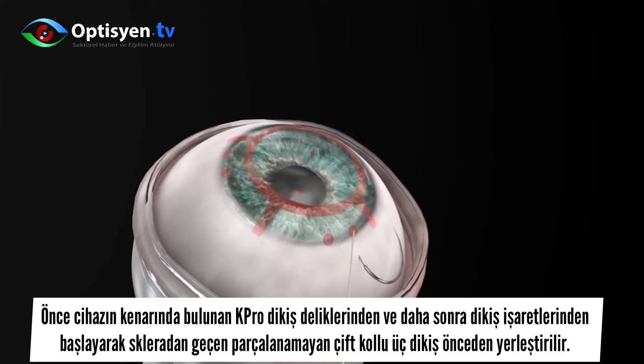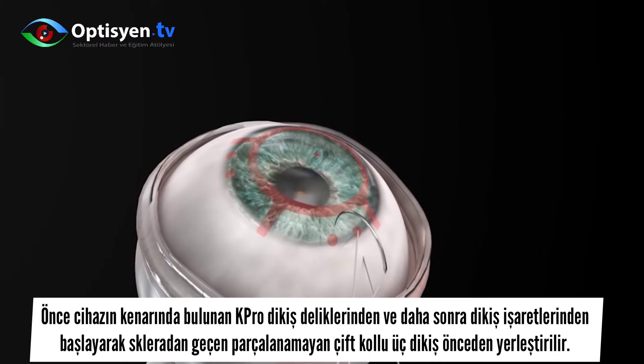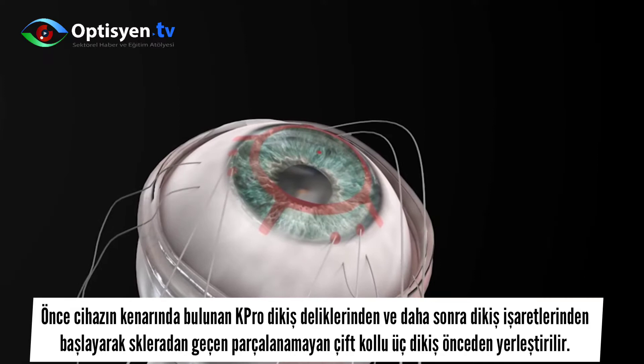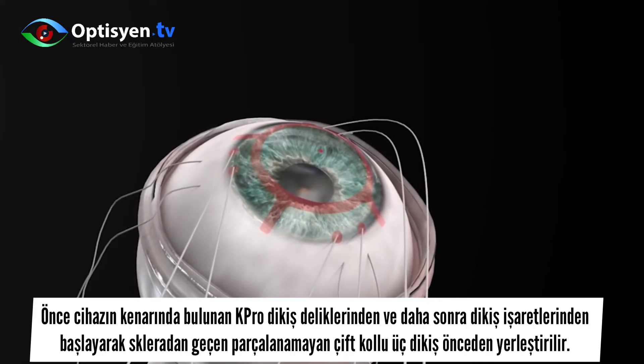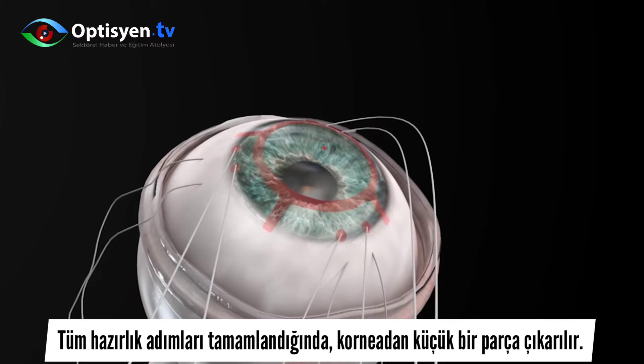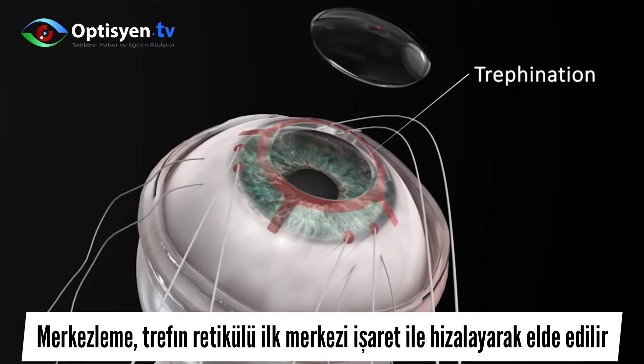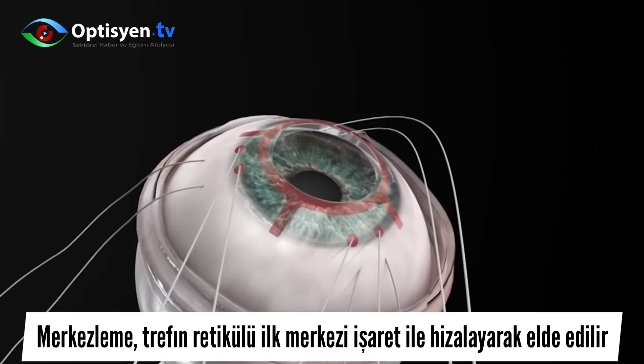Three non-degradable double-armed sutures are pre-placed, running first through the K-Pro suturing holes located at the rim of the device, and then through the sclera, starting at the suturing marks. Once all preparatory steps are completed, the cornea is trefined. Centration is achieved by aligning the trefine crosshair with the initial central mark.